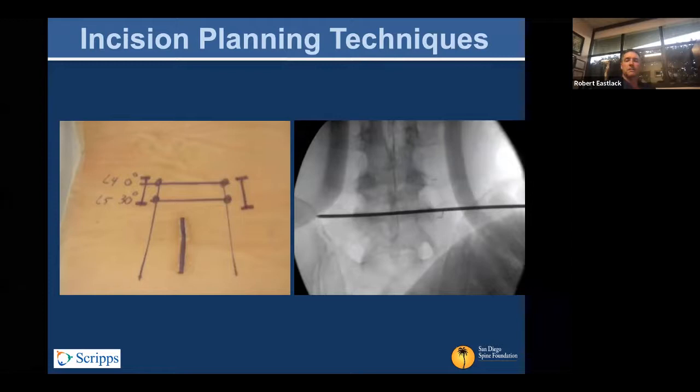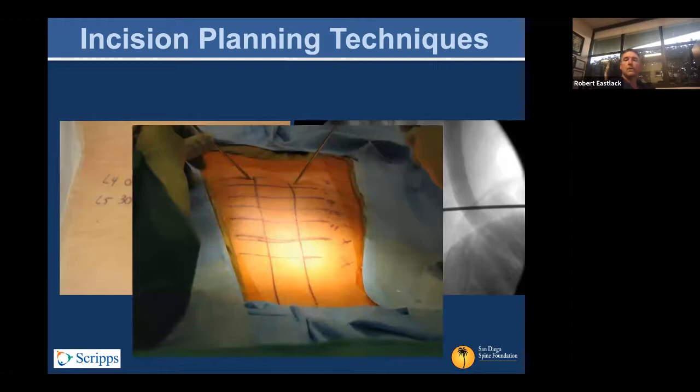The more critical feature of the incisions is how to place them cephalocaudad relative to the pedicles. The easiest aiming point is just lateral to the disc space. If you find the disc space between two pedicles, you can take a marking point about two to three centimeters lateral to midline — which will generally be about a centimeter lateral to your pedicle starting point, or maybe two in a larger patient. Once you've marked that point, draw a line a centimeter above and a centimeter below, and that should reliably get you to your starting points.